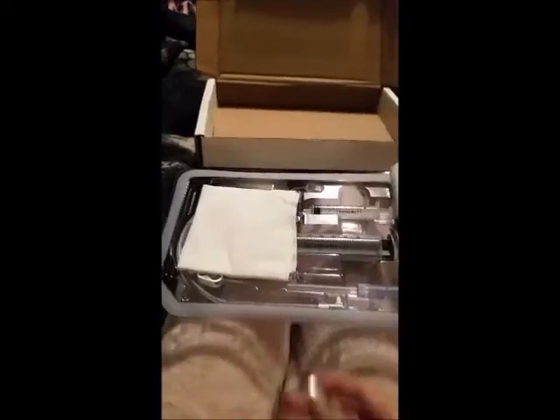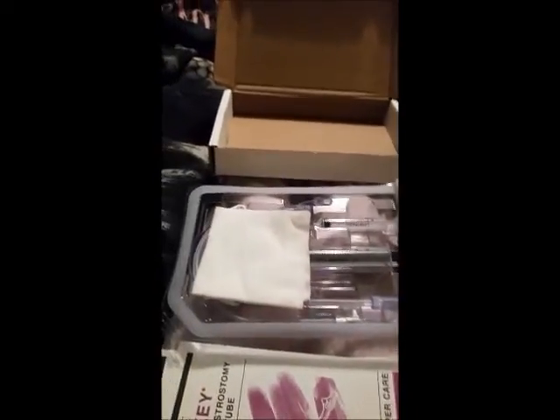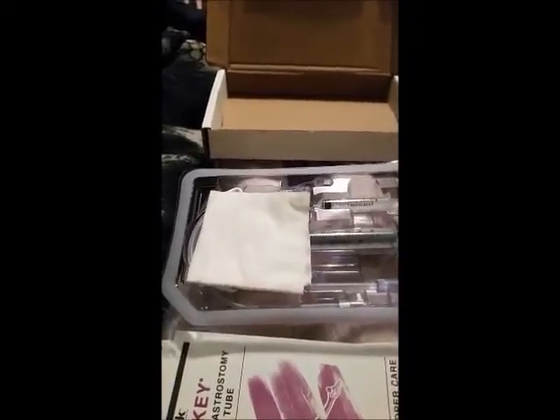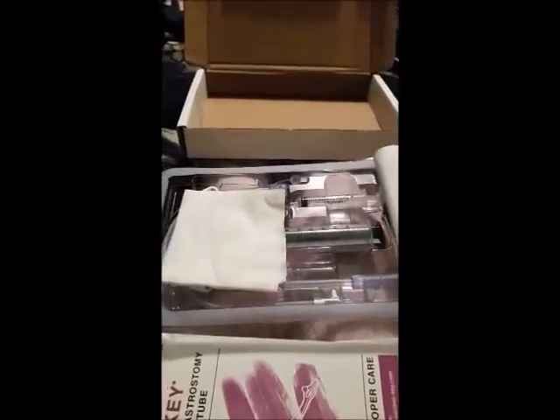Anyway, give me 1 second. Oops, sorry guys. I gotta pause it for a second to open the box. This is what happens when you don't have anybody helping you record. Okay, so I've opened the box and you have your gauze in here, which is important. You have to keep it as sterile as possible, but I'm on my bed, and I'll explain in a minute why I'm laying on my bed. But just try to keep it as sterile as possible.